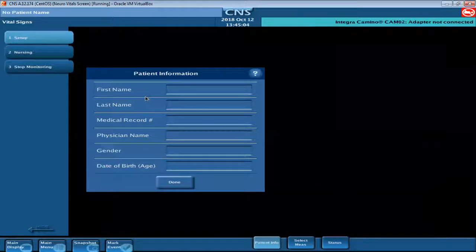So if your protocol starts to morph into different things that you don't recognize, they can always re-import that baseline protocol. So if you find that your protocol is drifting, check with, it might be one of your nurse practitioners, it might be your educator, it might be your manager, but someone in the institution should have received that protocol that they have on a thumb drive.